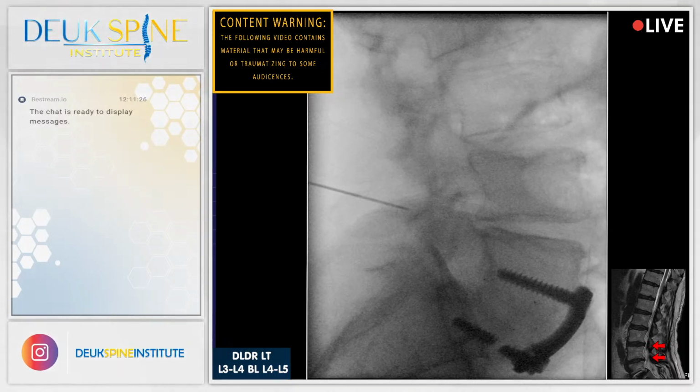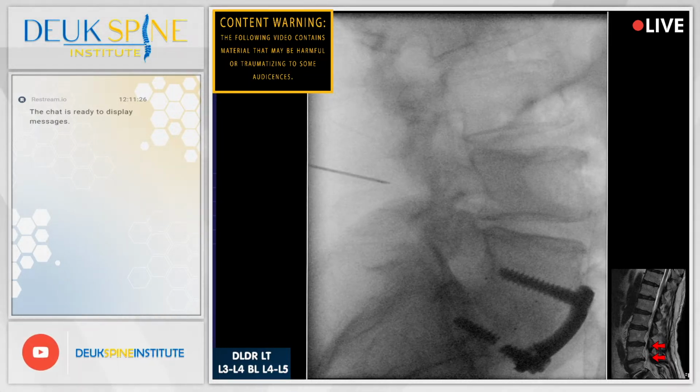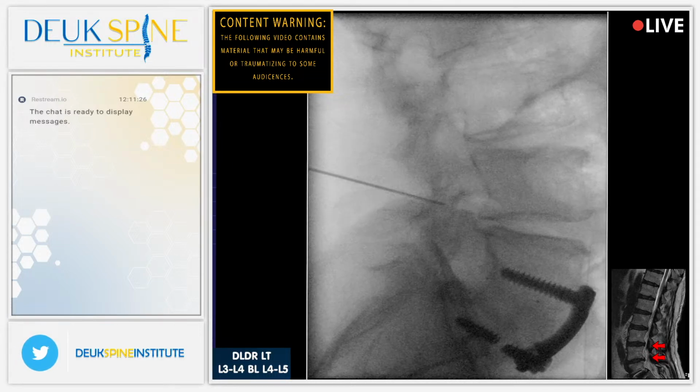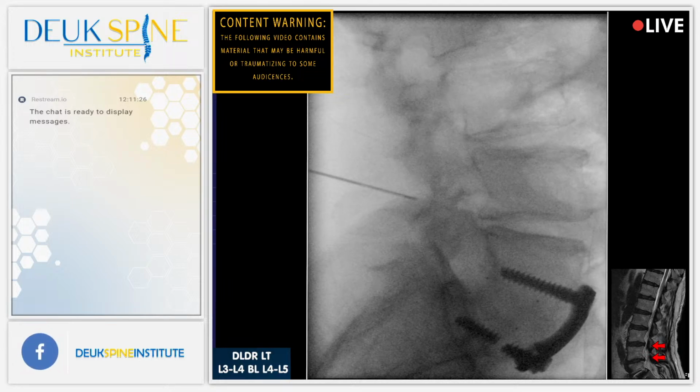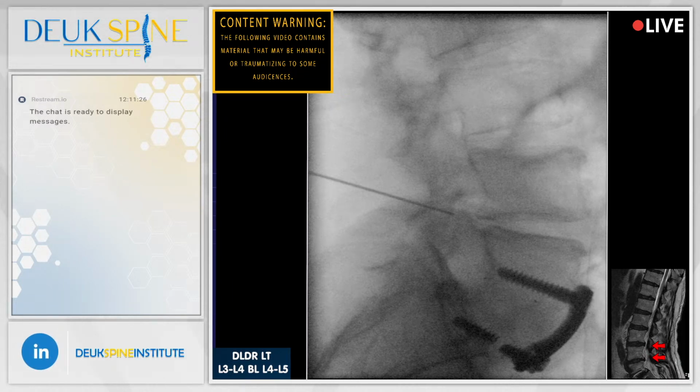Thank you. Shot. I'm encountering a very arthritic facet joint. So I'm going to have to start a little bit more lateral and try to get around this facet joint. Shot. And I can tell you already he has one of those spines that's pretty anterior. Shot. Because I'm having to really go at a steeper angle than normal to get there. I'm feeling the facet. So let's go with right there, shot, and then let's get an AP.